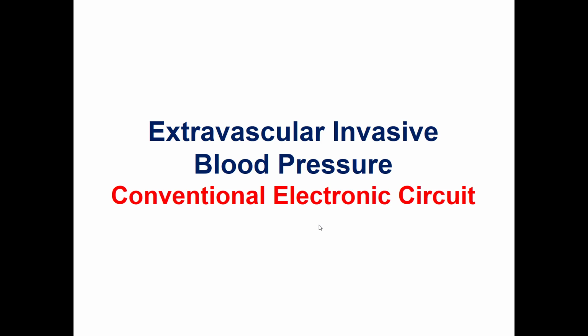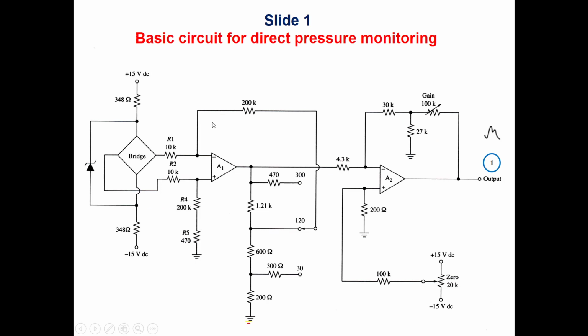If we have a slow ADC, we need to do most of the signal processing in the analog domain, whereas after having a fast ADC, we don't need to do this signal processing in the analog domain anymore. We rather do it in the digital domain. But I will talk about the analog domain to give some idea of how the electronic circuit design was done before.